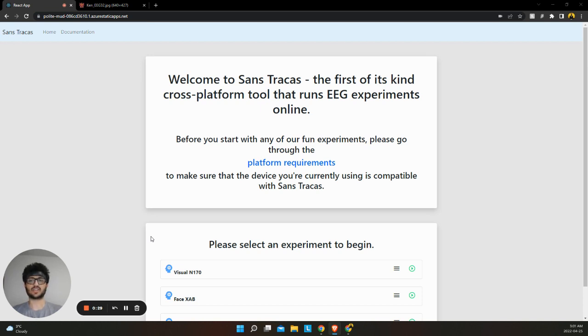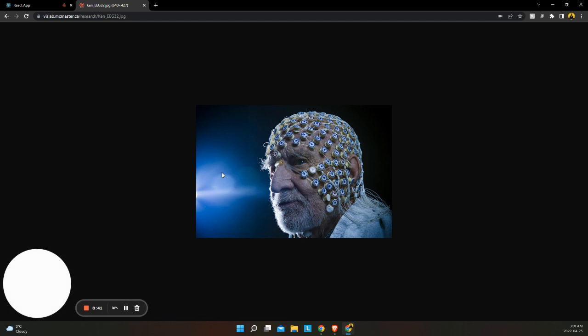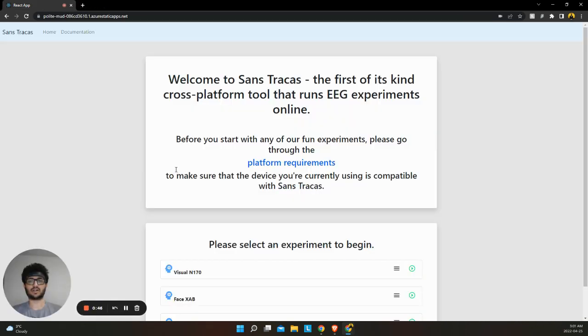First, what is EEG? EEG stands for Electroencephalography and is a method of recording the electrical activity of the brain from the scalp. Traditional EEG devices that you find in a lab could look like this and have many channels. These days, there are also several consumer-grade EEG devices, such as the Muse EEG headband that I'm currently wearing, which are easier to use and are accessible to you and me.